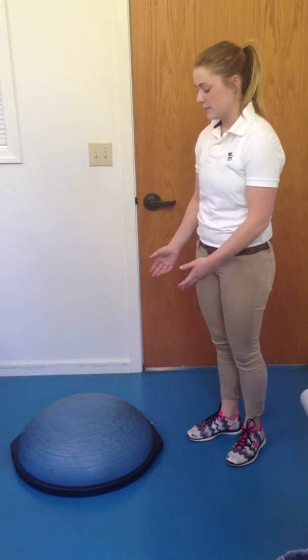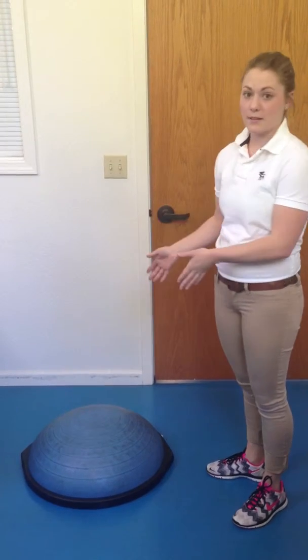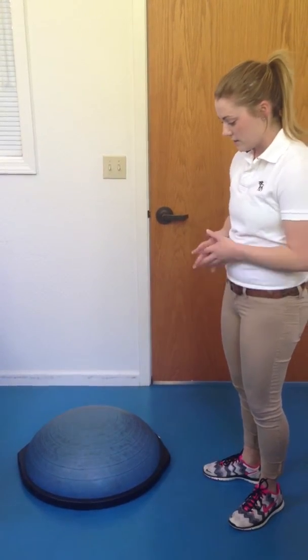This is the BOSU ball, which is commonly used in rehabilitation with athletes. It adds a new element to their rehab by encouraging them to use their balance, making exercises a little bit more difficult. There are a few things that you could do with it.